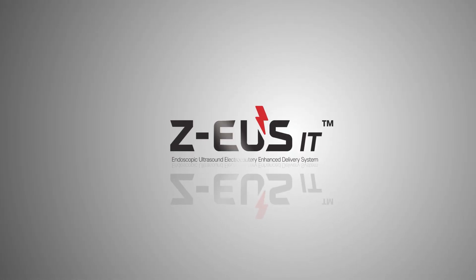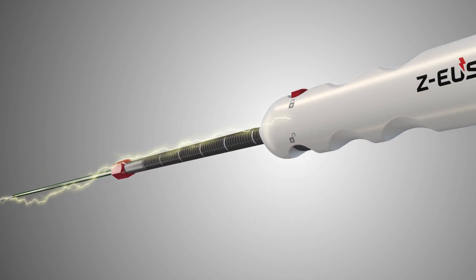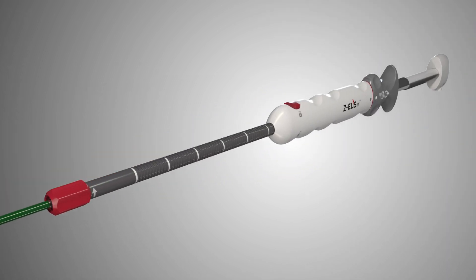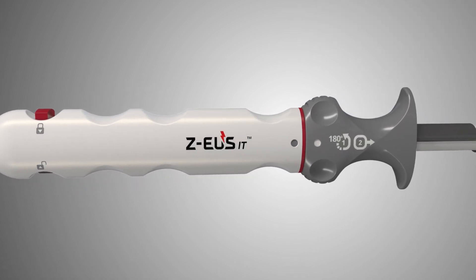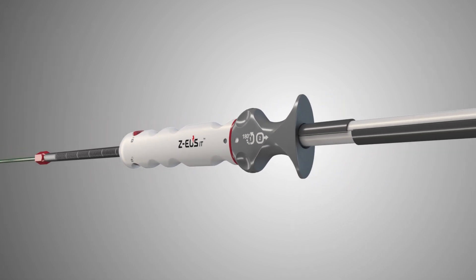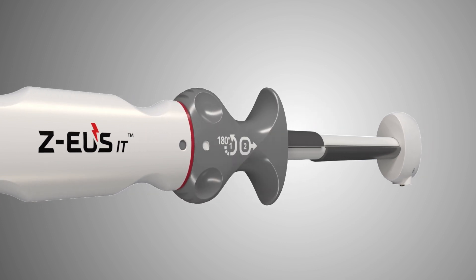MI-TECH ZEUS-IT Endoscopic Ultrasound Electrocautery Enhanced Delivery System. ZEUS-IT is an endoscopic electrocautery enhanced delivery system that creates anastomosis between the GI tract and target structure to place a stent in the targeted location. ZEUS-IT is designed to shorten procedure time by penetrating the target location with one-step access.